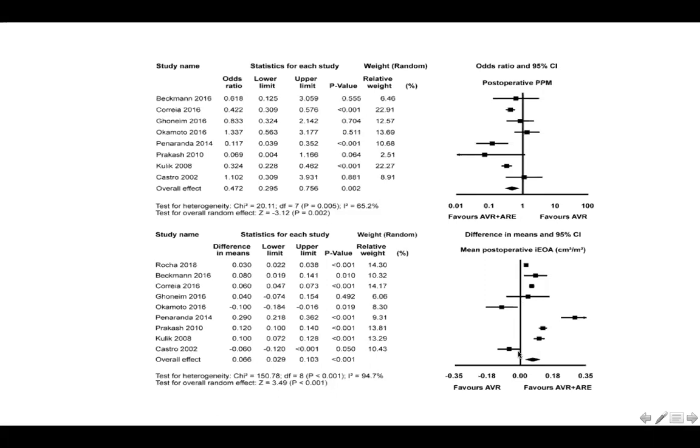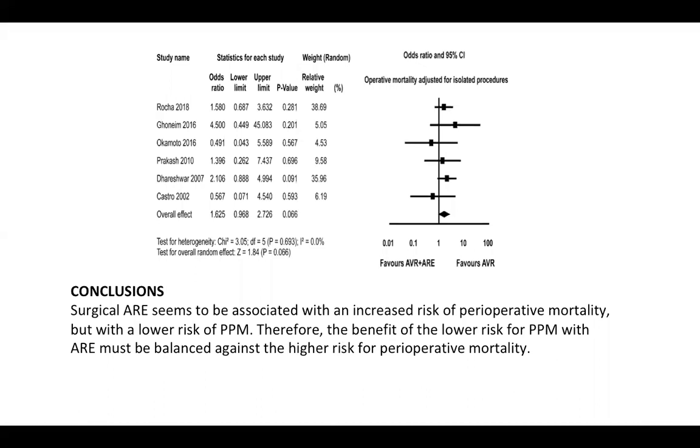Overall, they found that enlargement with AVR is associated with increased risk of perioperative mortality, but no significant differences in mid-term mortality.